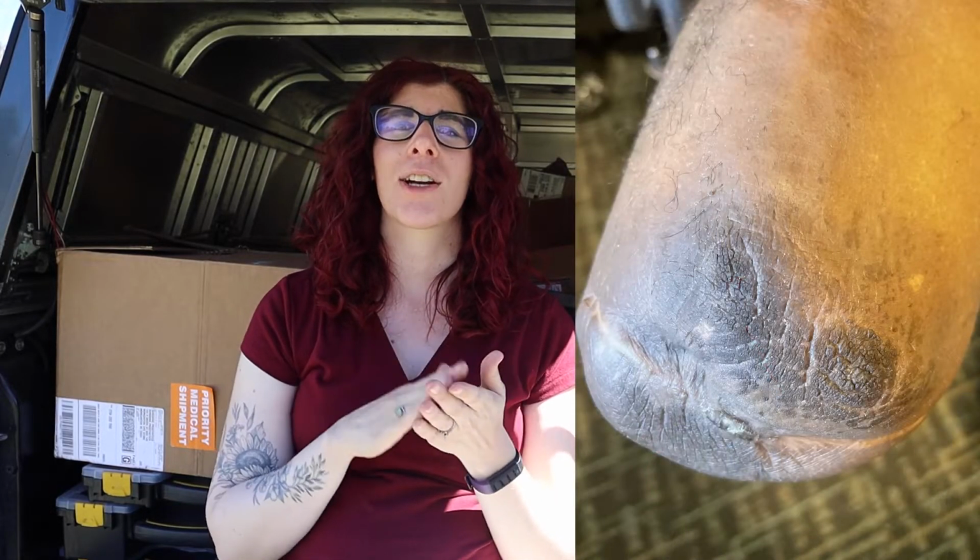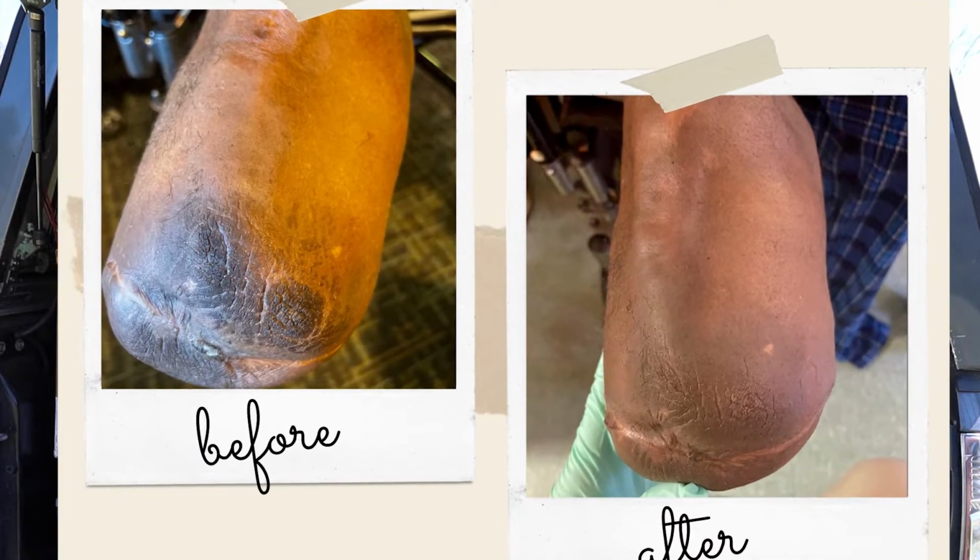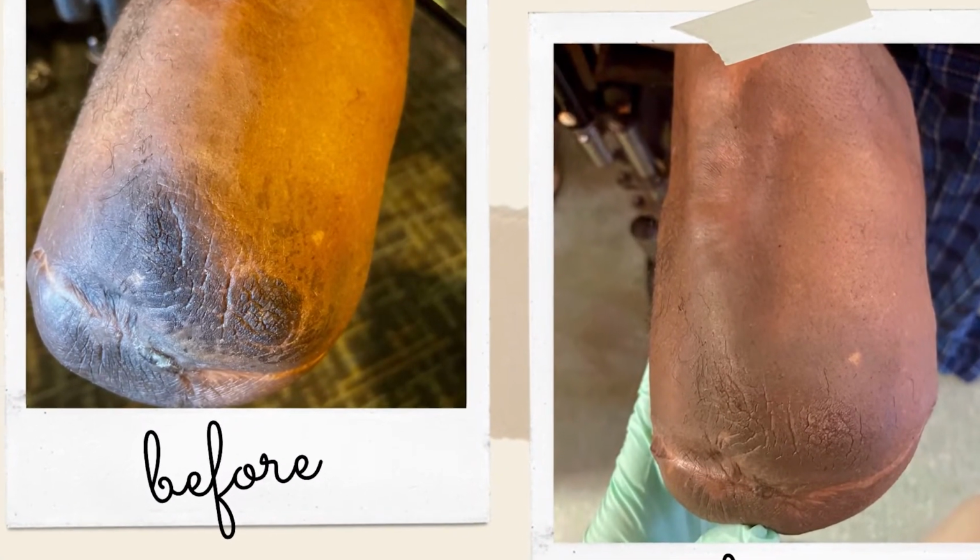Before we get into the casting, he had a pretty big callus, just a hardened skin area on his distal limb. This is just one week's difference using lanolin on his distal residual limb, and you can see just in that one week how much healthier that skin is. So let's get started with the cast.